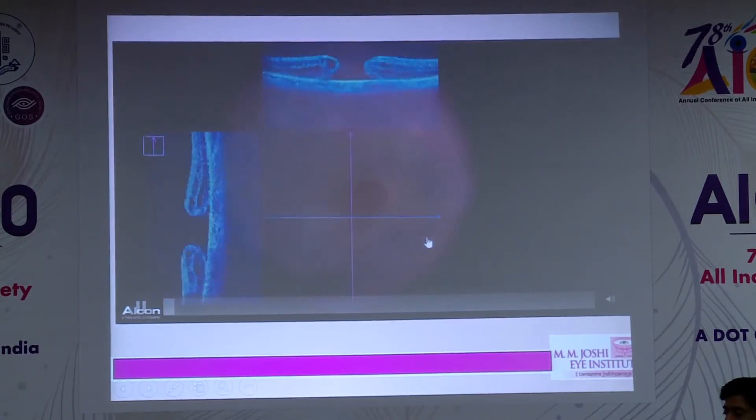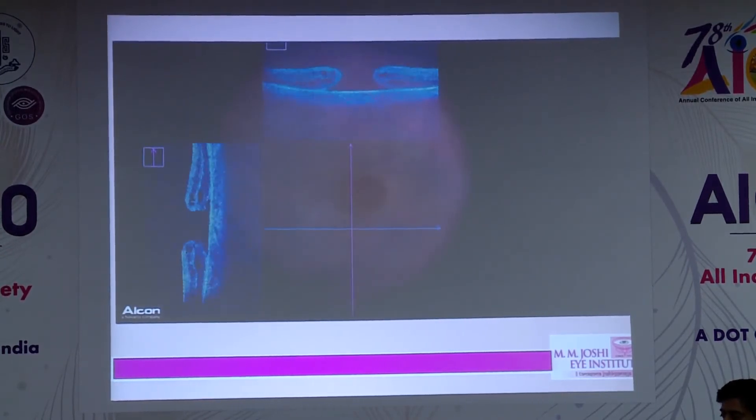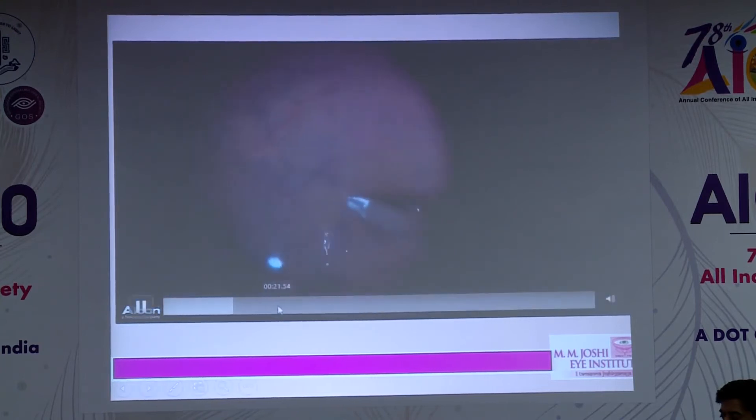With good intraoperative OCT and 3D visualization, the vertical and horizontal split appears on the screen itself, where you can visualize the placement. You can now see I'm performing the procedure under PFO.